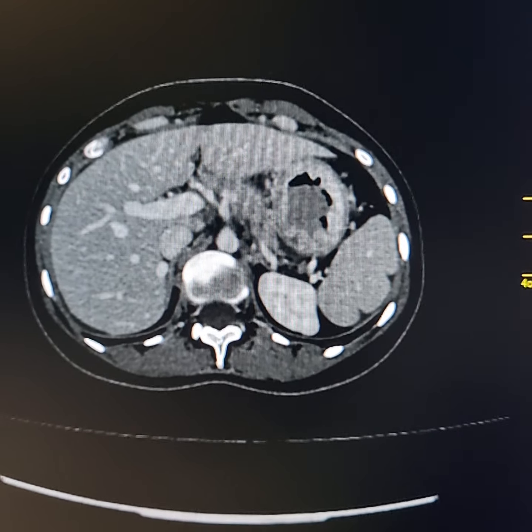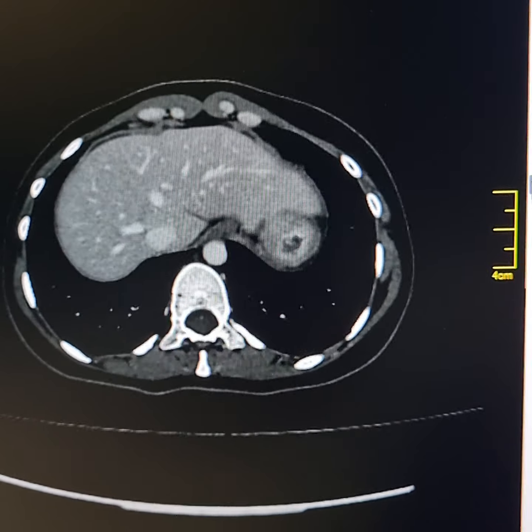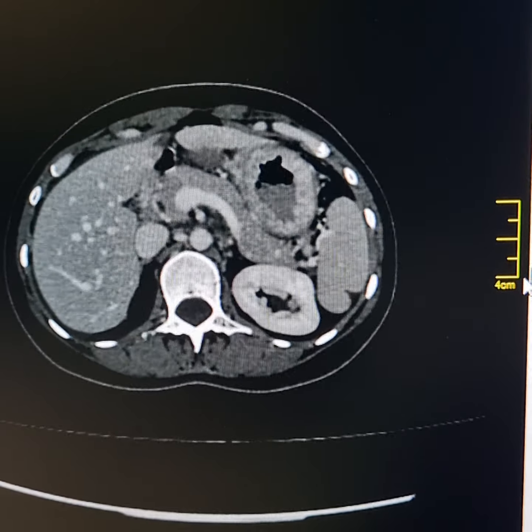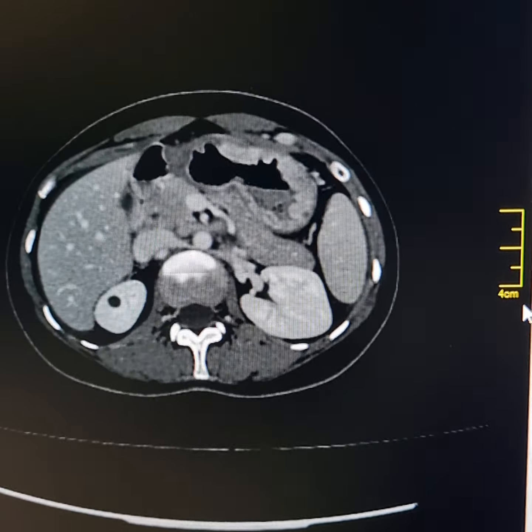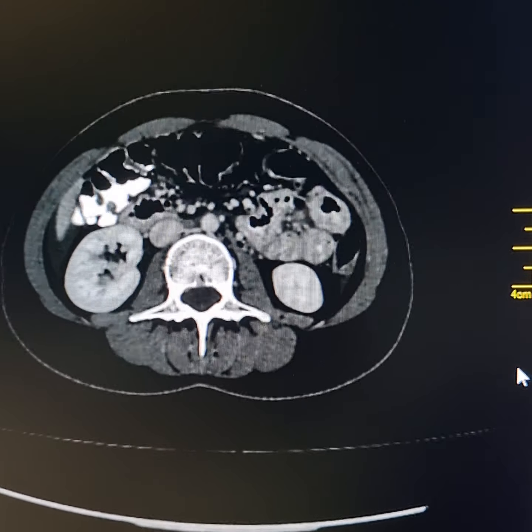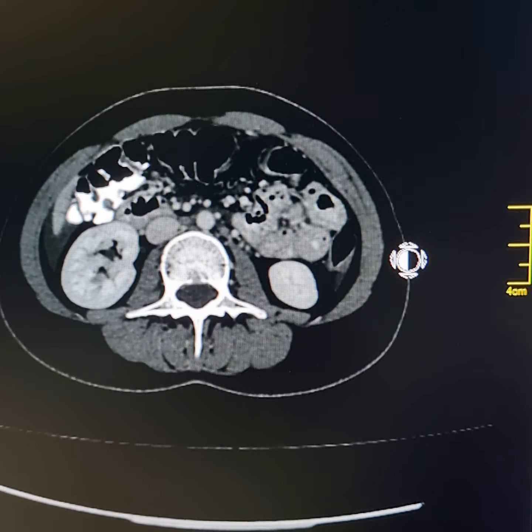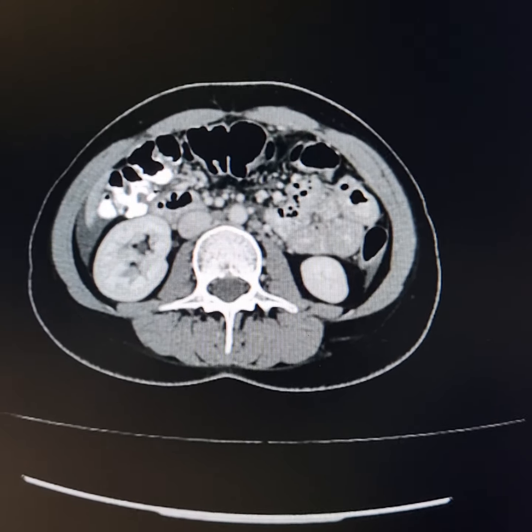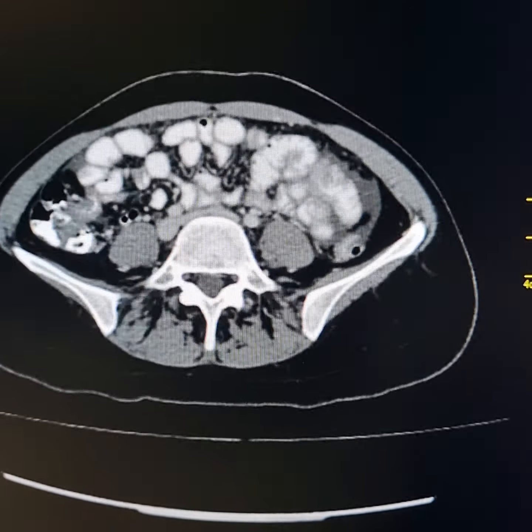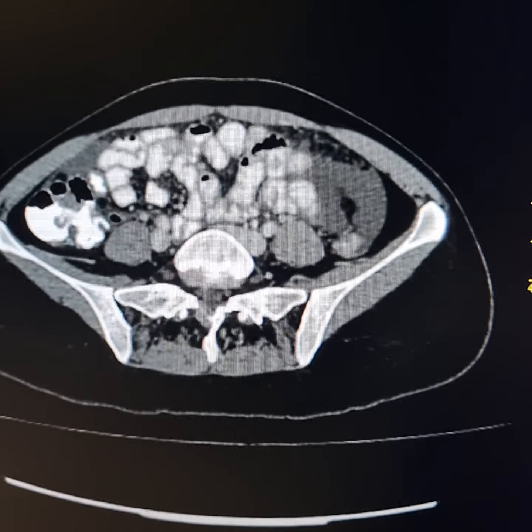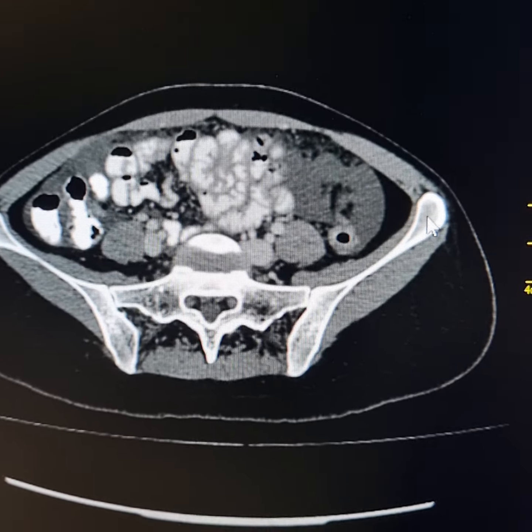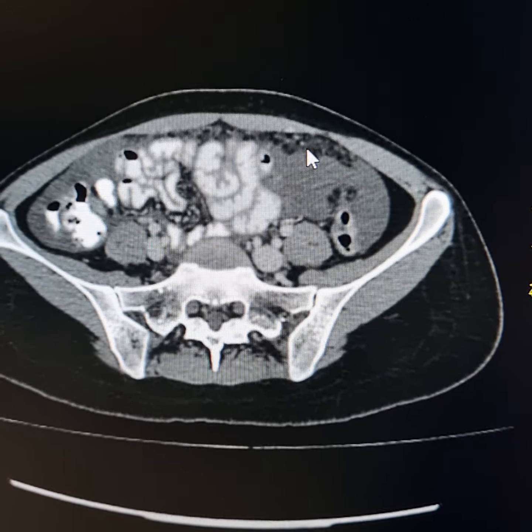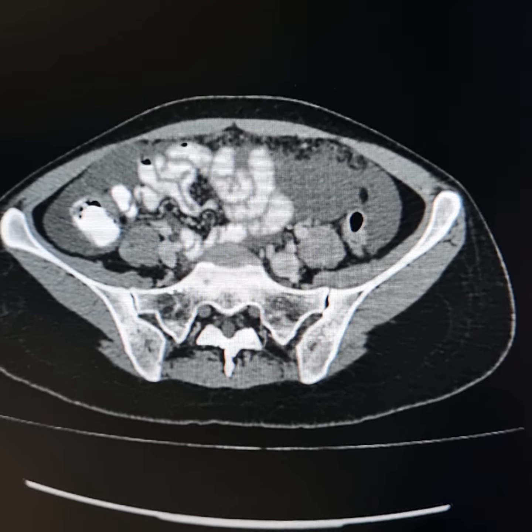This is the case of pyloric carcinoma of the stomach. As I scroll down, there is mild ascites. Please observe here slight thickening of the greater omentum. This is the thickened greater omentum here.